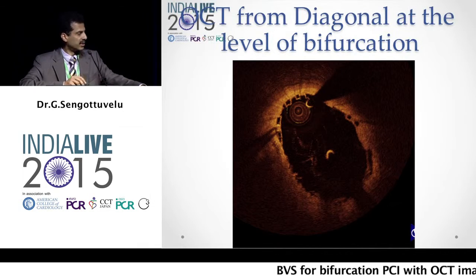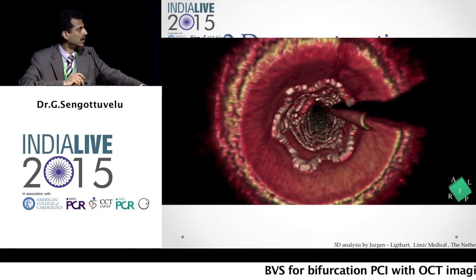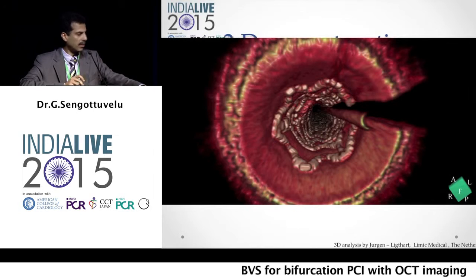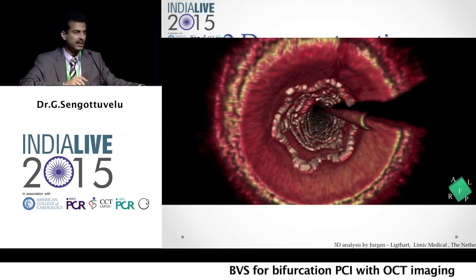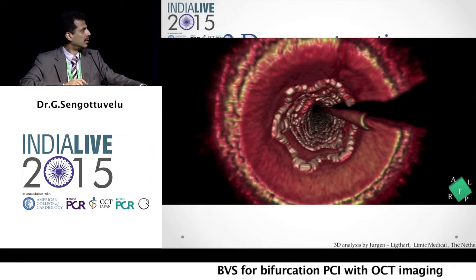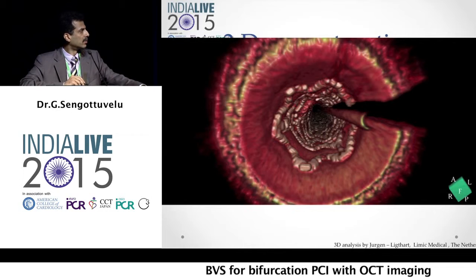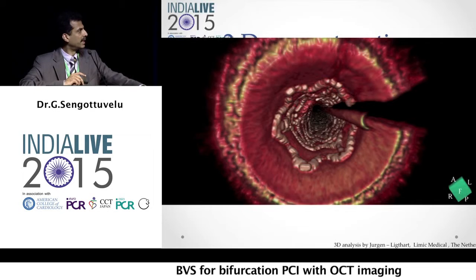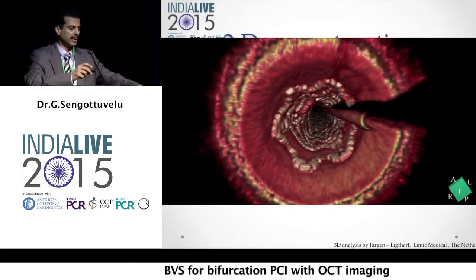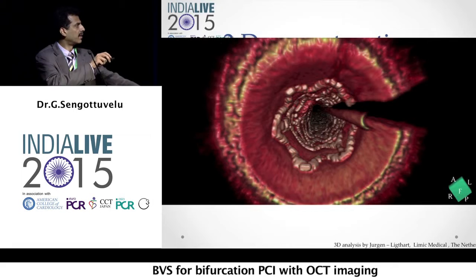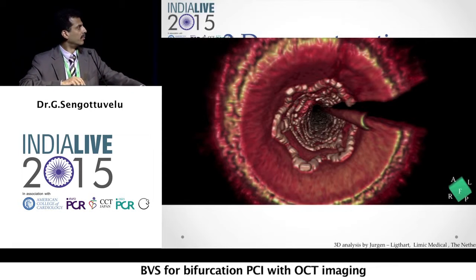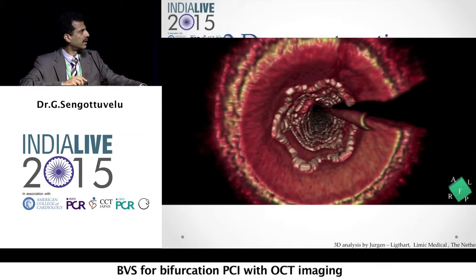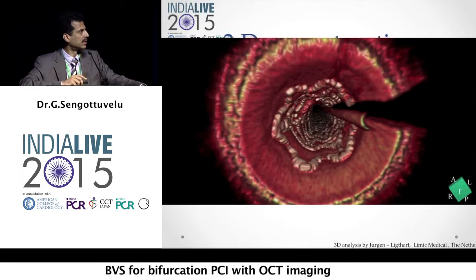We did a 3D reconstruction, and you could see that the absorb scaffold is well deployed. This is a fly-through image where you could see the scaffold well deployed, along with the guidewire artifact. There is no disruption of the scaffold when we deployed at high pressures using the TAP technique, and the scaffold was well deployed throughout.